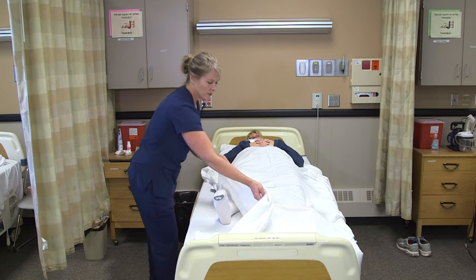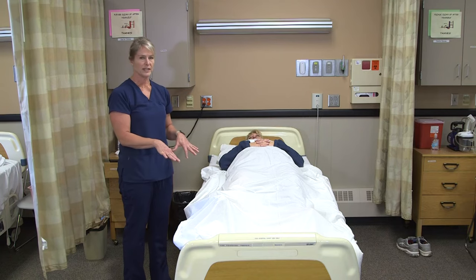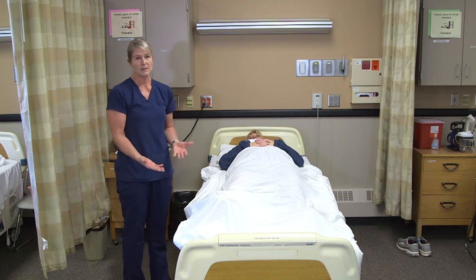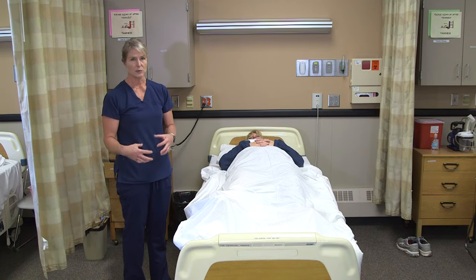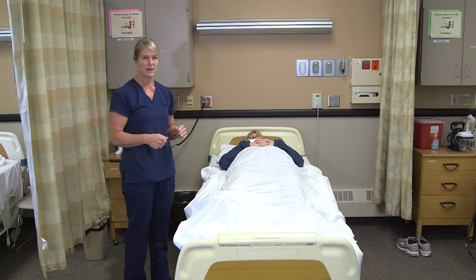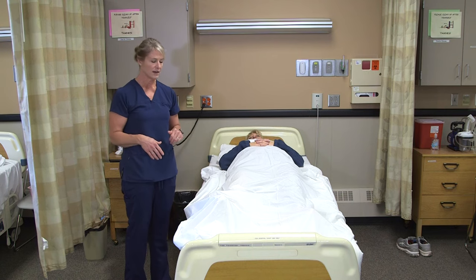We put Ted hose on in the morning when the resident has been laying flat, so the swelling in their legs should be at its lowest since they're at heart level. We keep them on during the day because as they sit, blood and fluids tend to pool in their legs, and the compression gives a little squeeze to push that back into circulation and return it to the heart. So usually on in the morning, off in the evening.